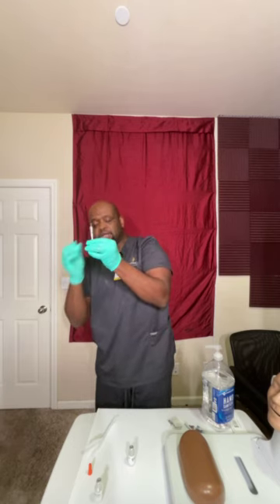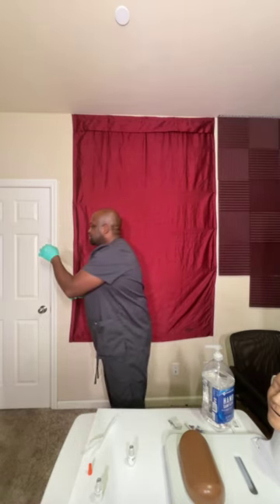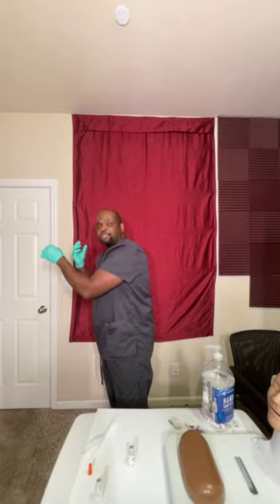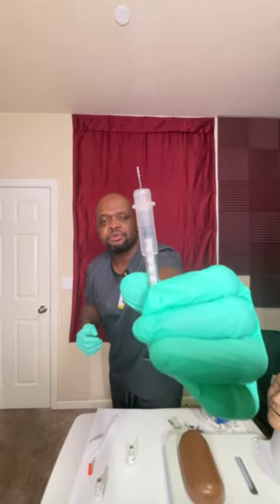And we want to remove the syringe before we tap it for bubbles, because we don't want the medication to go back into that bottle, right? We want to tap it after we remove the syringe. She's going to verify that it's 4 units. I'm sorry, that is 8 units, making it a total of 12 units. I'm going to show that to you guys, right? A total of 8 units, making it 12, right? Now we're going to check it against the medication administration records.